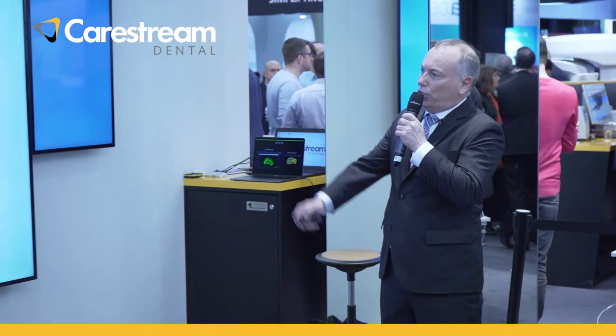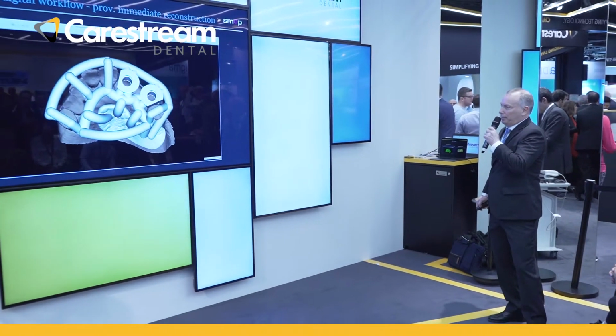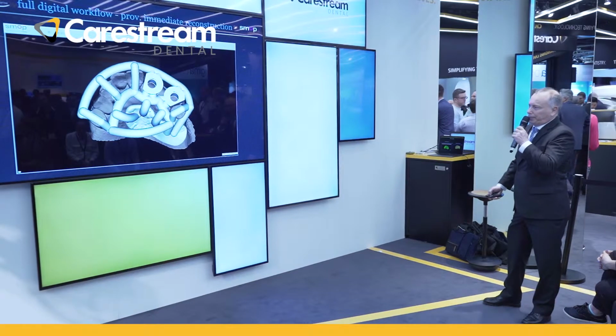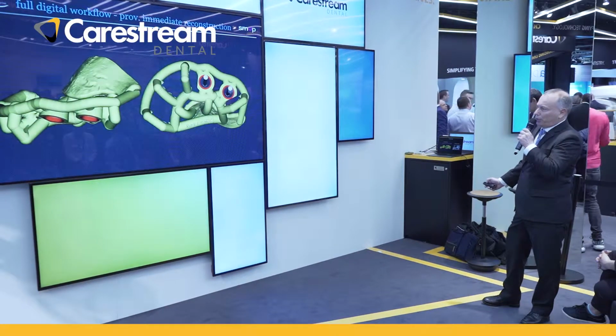You see how the tissue support was created, and after about 30 seconds, you have the final template. Okay. You see here again on the pictures.